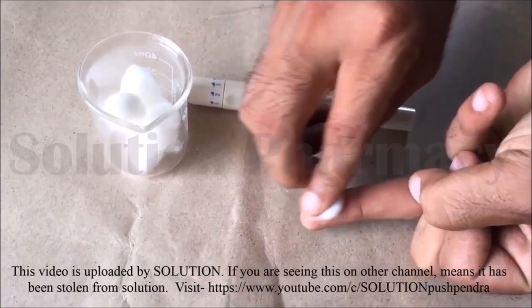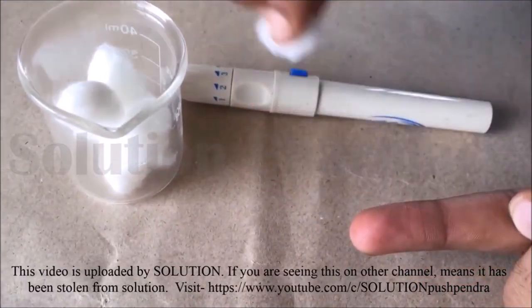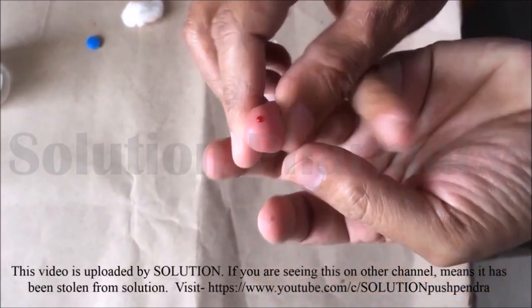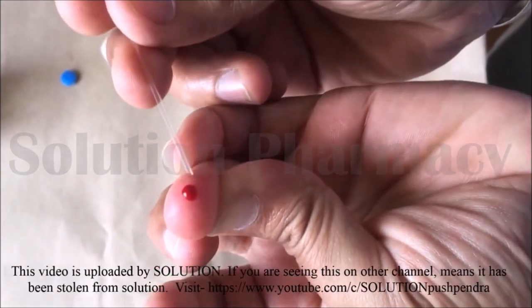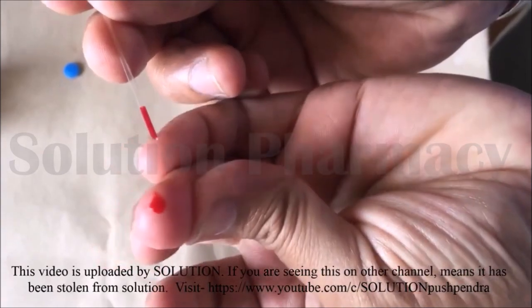First of all, let's learn how to fill blood in the capillary tube for blood clotting time determination without entrapment of any air bubble inside it. For this, first of all, sterilize the fingertip with a cotton swab soaked in ethanol, and then with the help of a pricker pen, prick the fingertip, and allow the blood to ooze out, meaning release from the puncture site of the fingertip, and then gently touch one open side of the capillary tube to the surface of the blood drop.